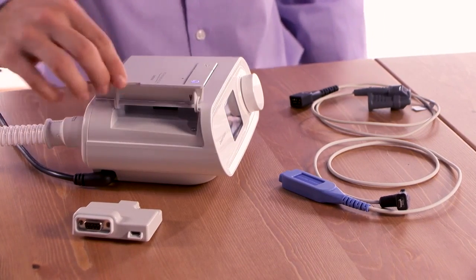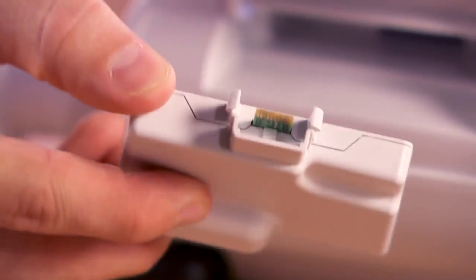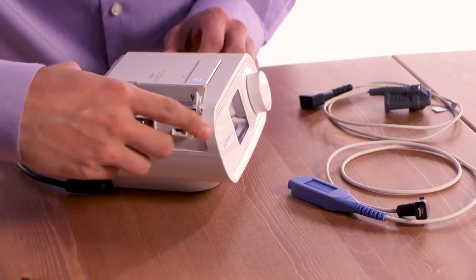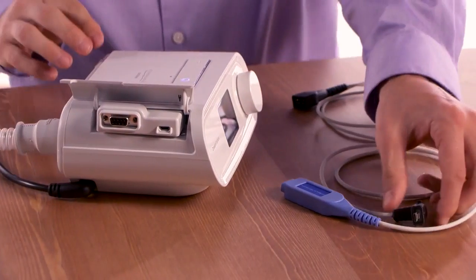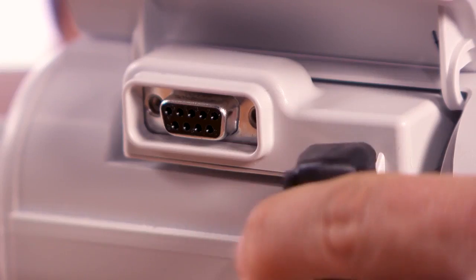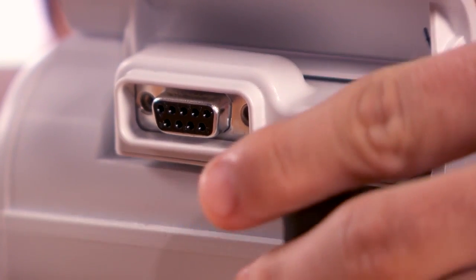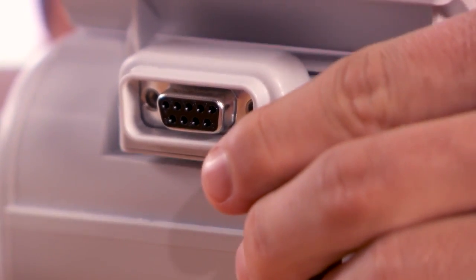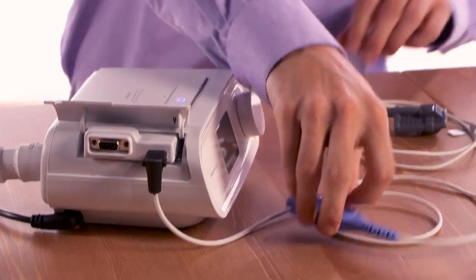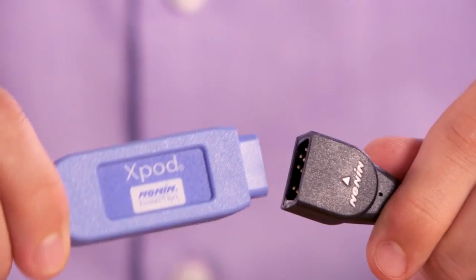Start by opening the accessory door and inserting the link module, connector end first, until it clicks into place. Next, connect the oximetry module's 90-degree plug into the micro-USB port on the link module. Then, connect the oximetry sensor to the oximetry module.